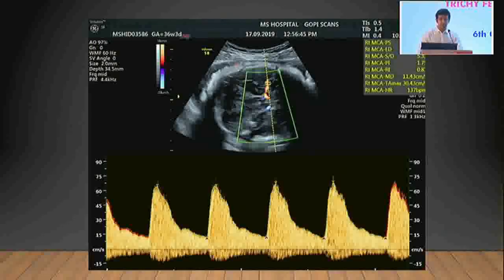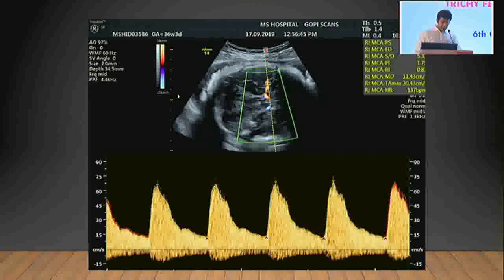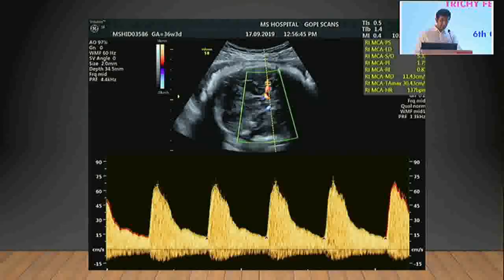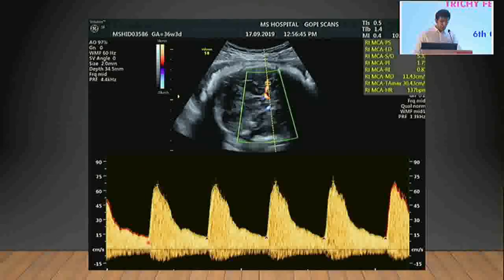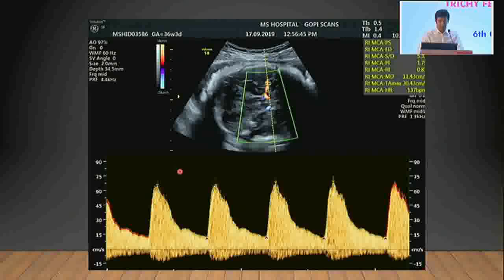Here I have done a Doppler of the MCA — the middle cerebral artery. You can see the line of insonation and the gate placed on the middle cerebral artery at the most vertical part, so I am getting a proper waveform with a proper velocity.